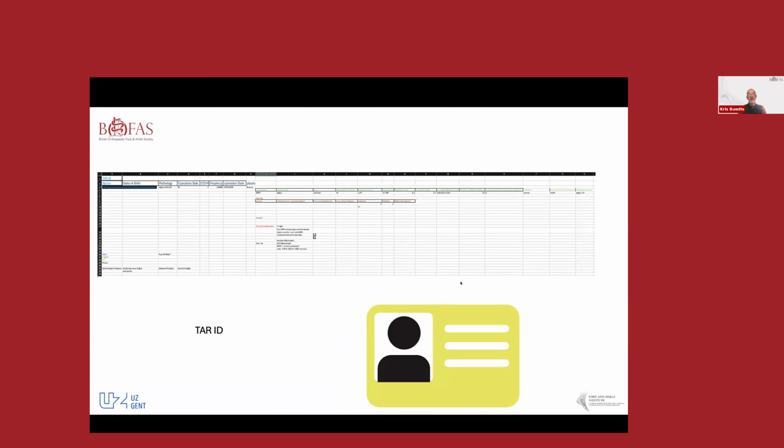So what we actually try to do is build an ID for all of our patients. I will put every piece of information that I have of a total ankle into an Excel file, where we look at the knee joint, the foot position, the foot deformity, and the degrees of deformation in varus and valgus. Every piece of information that I get out of my X-rays and out of my plan, I put down in an Excel file, and then from there I try to plan my surgery.